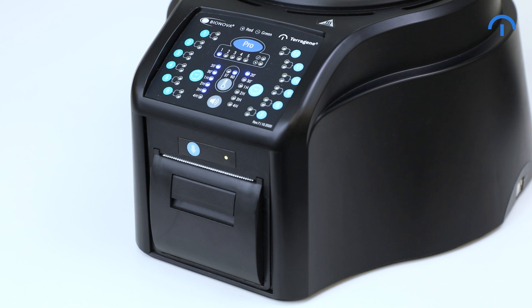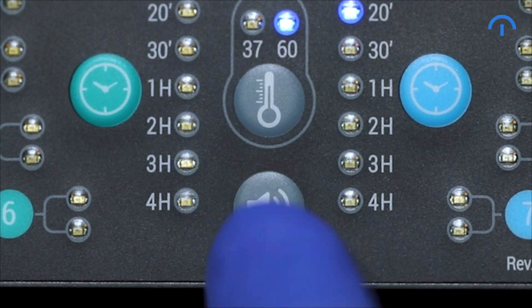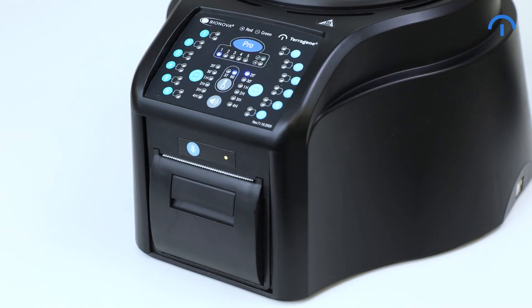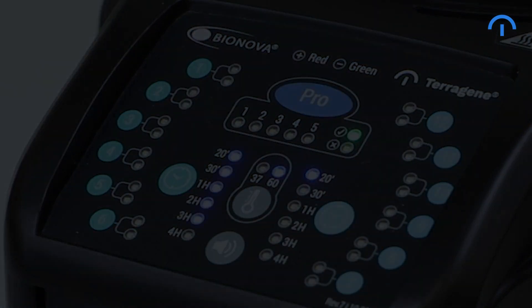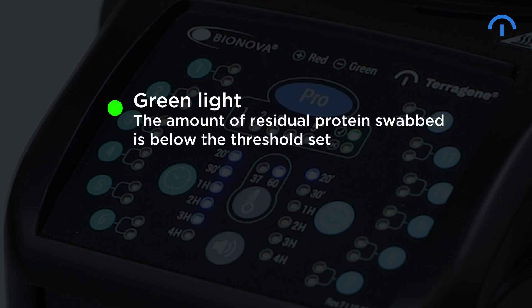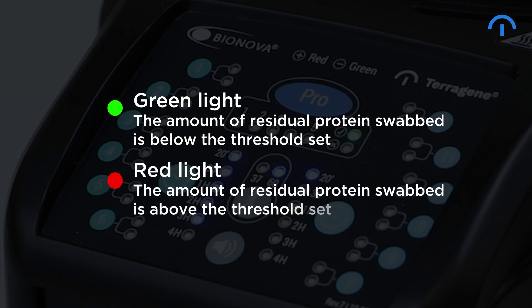You can turn off the alarm by pressing the alarm button. When the incubation is completed, the autoreader will print the results and display a red or green light. Green light means the amount of residual protein swabbed is below the threshold set. Red light indicates the amount of residual protein swabbed is above the threshold set.